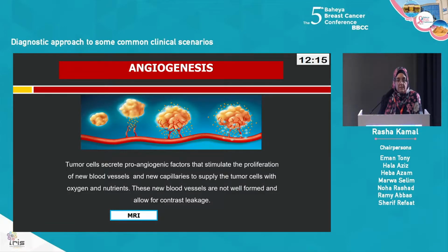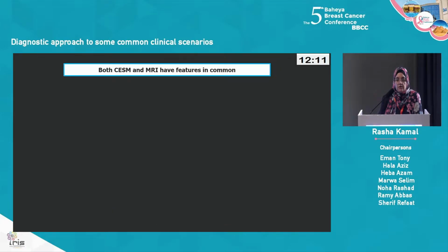And that's what we depend on in MRI and contrast mammography. Both contrast mammography and MRI have features in common. In both modalities, we inject contrast media in order to highlight areas of concern within the breast. But the way we do this is different in MRI than it is in contrast mammography.